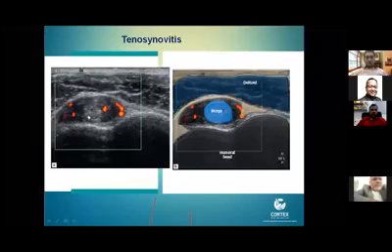This is one pathology around the biceps tendon. You can see this is the biceps tendon surrounded by fluid. You can see the fluid, and on color Doppler it is showing hypervascularity. That shows that it is inflamed fluid, which is suggestive of tenosynovitis of the biceps tendon.